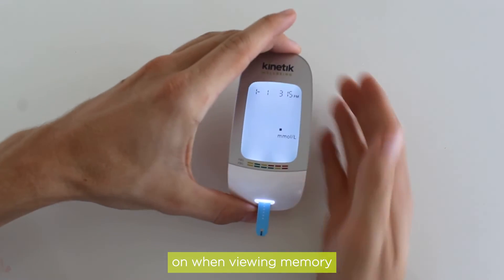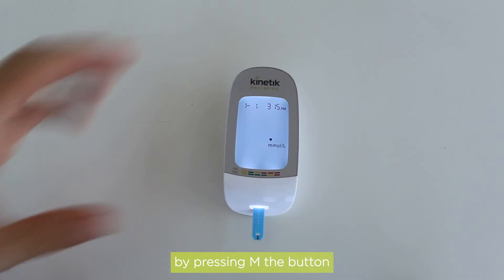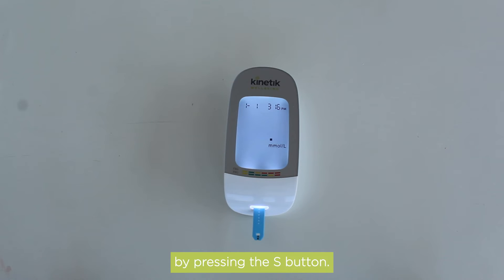The meter should only be turned on when viewing memory by pressing the M button, or to set the device by pressing the S button.